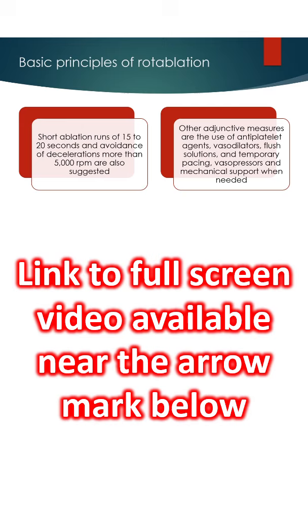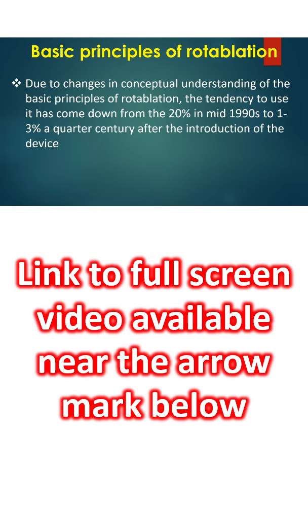Other adjunctive measures are the use of antiplatelet agents, vasodilators, flush solutions, and temporary pacing, vasopressors, and mechanical support when needed. Due to changes in conceptual understanding of the basic principles of rotablation, the tendency to use it has come down from the 20% in mid-1990s to 1 to 3% a quarter century after the introduction of the device.